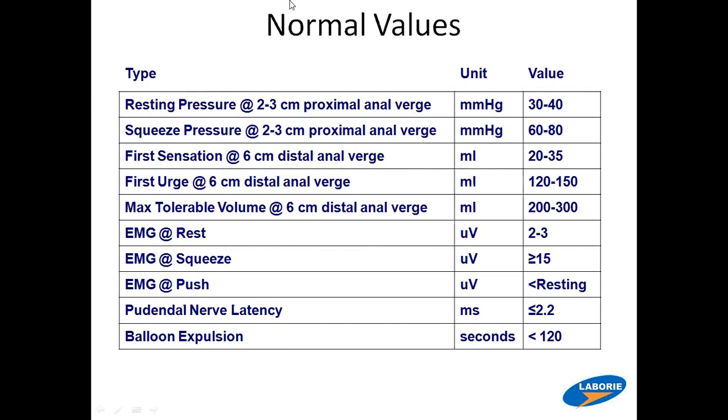Now, you know they can drink. What really ruins it is, I'll just tell my patients, I need the last 8 inches of your rectum empty. So what stimulates it is a big lunch. They go for lunch and get that contraction, you remember that slide with all the motion on it, and they're going to push stool down into the rectum. So it's just a couple Fleet's enemas.